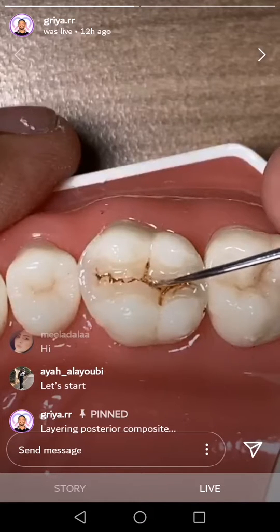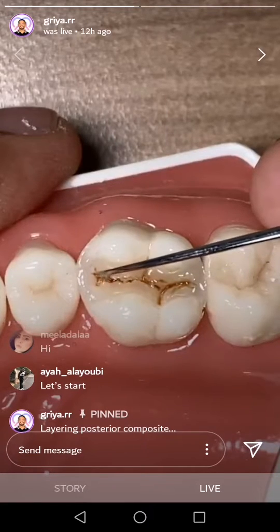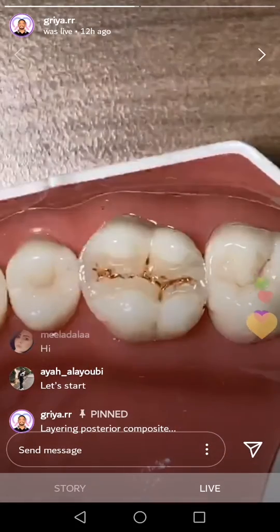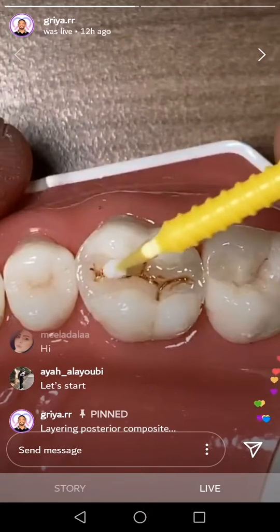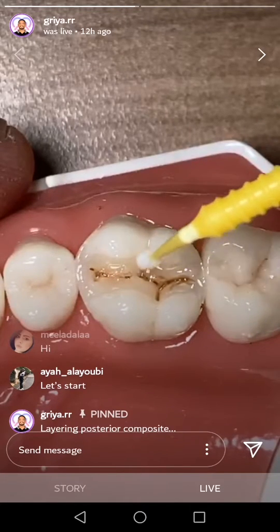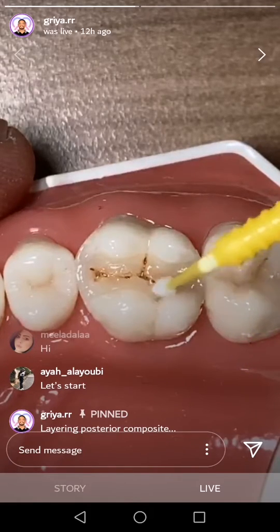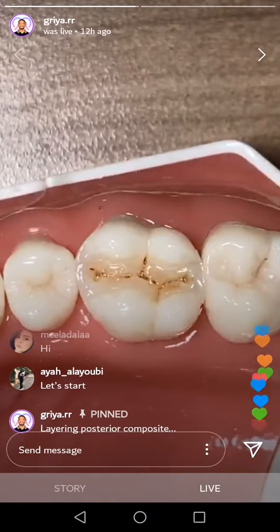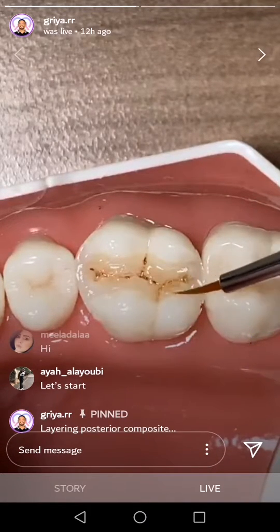If you don't want to use this stain, it's okay, but you need to tell your patient, yeah. If your patient does not agree with you, yeah, you need to remove this stain, because the stain looks like you still have a brown situation in the fissure. So that's not good for your patient, bahkan ya pasiennya kadang-kadang mikirnya ini belum ditambal itu.